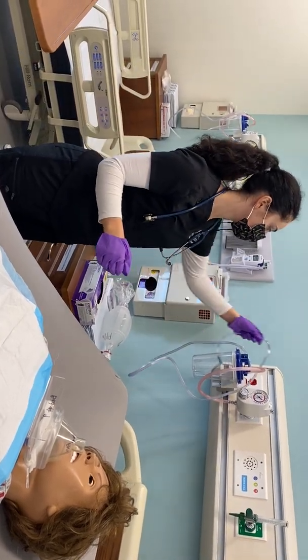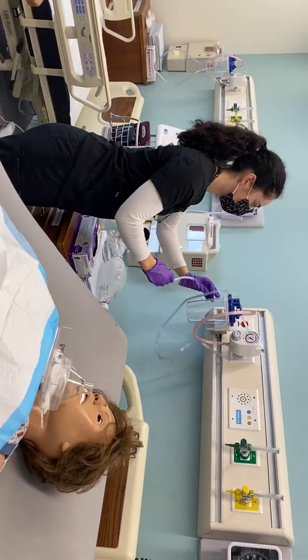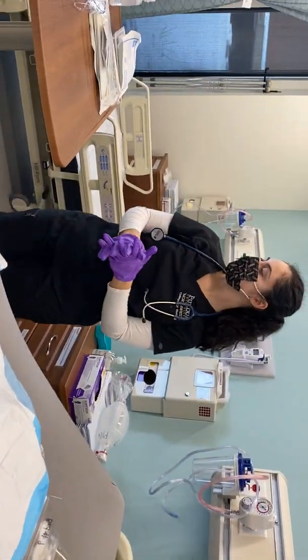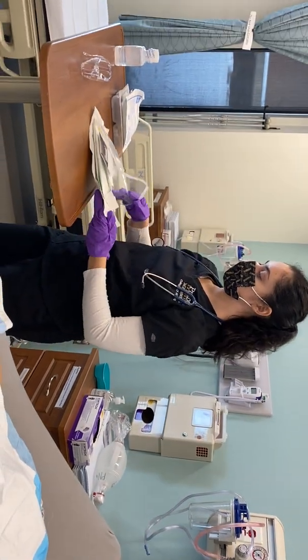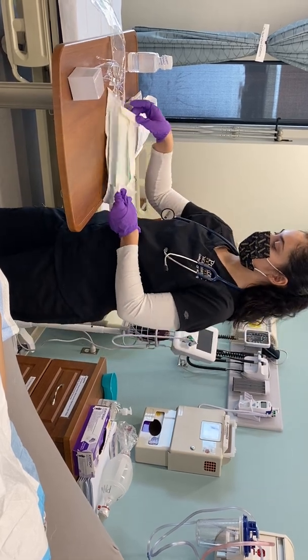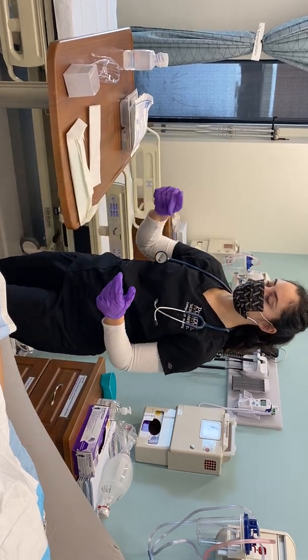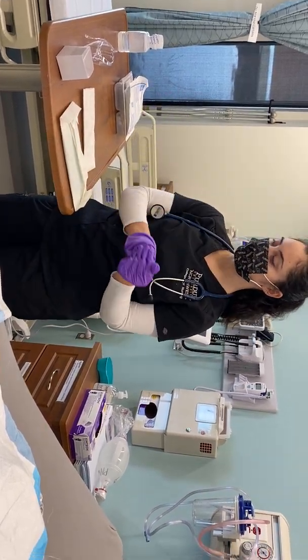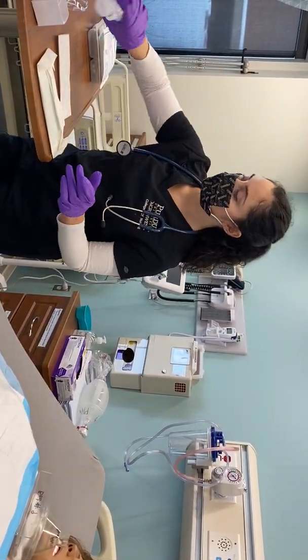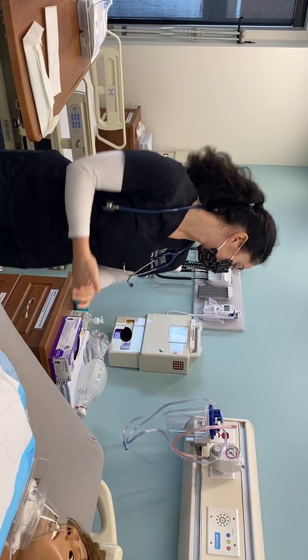Okay, now it should have been a little bit now. I'm going to check for the suction. Okay, the suction is good. All right, and while that's going, just going to place that right back there. Okay, and then while we're doing that, I'm also just going to open this, take my box out, take my sterile gloves out, take the suction tube out, discard of this in the trash can, which I have, and also now I'm just going to take the saline. I'm going to lip it. The expiration looks good as well. I'm going to pour some in here. Okay, now I can take off my gloves. Okay, now I'm going to do hand hygiene.